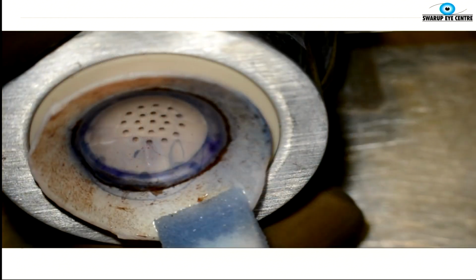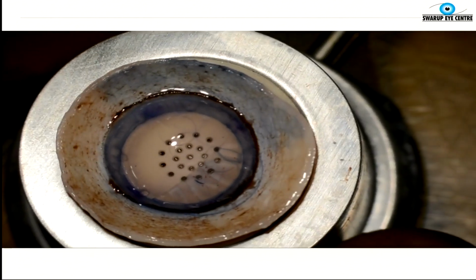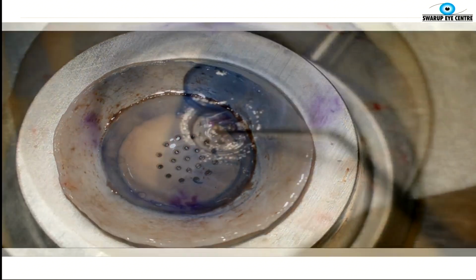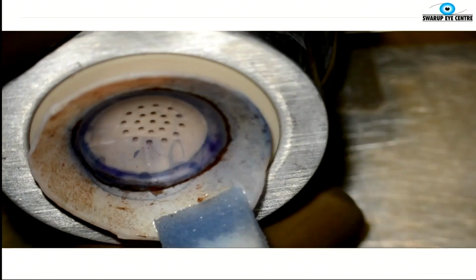And once you've stripped about 2/3, you can just make it lie down, and you have to stain this part so that you can identify the stripped from the unstripped area. That's what we're going to be doing. And once you've done that, you put it back, you invert the graft, and I'm sorry, I think I skipped one video.